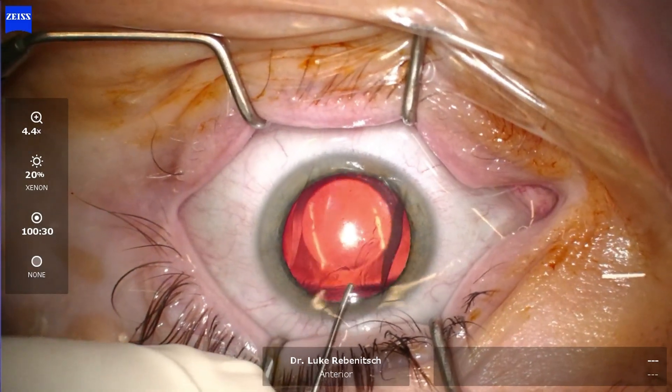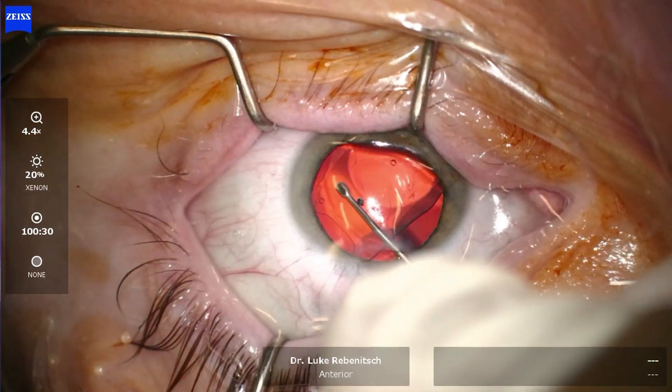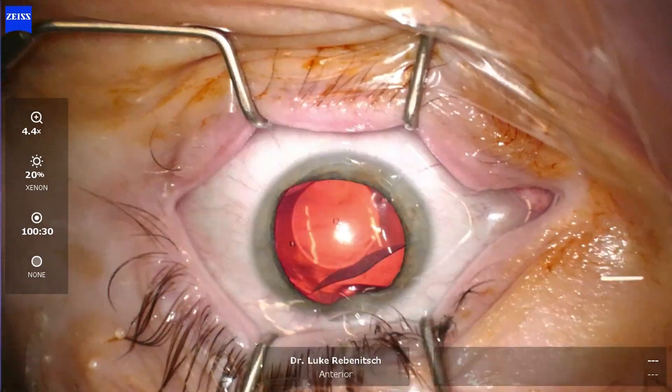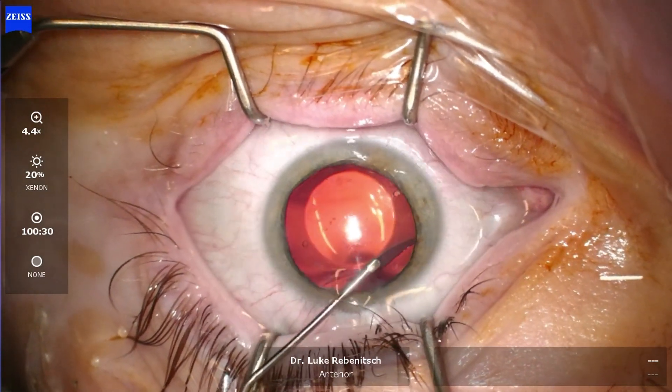Now you can see that the lens was unrolled in the correct orientation. More OVD, or jelly-like substance, was placed inside the eye. Now we rotate this lens into the horizontal orientation. This lens can be placed in a vertical or oblique orientation; however, typically sizing is calculated for horizontal placement.